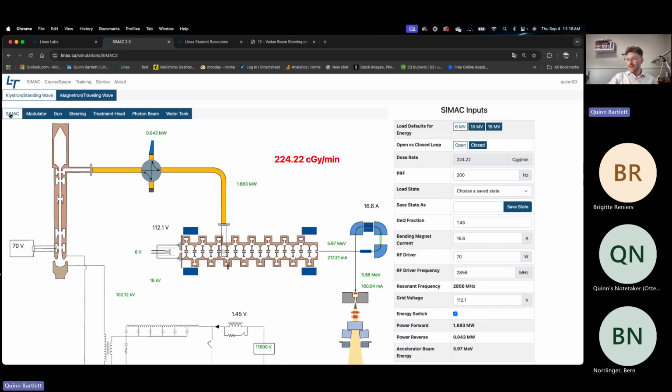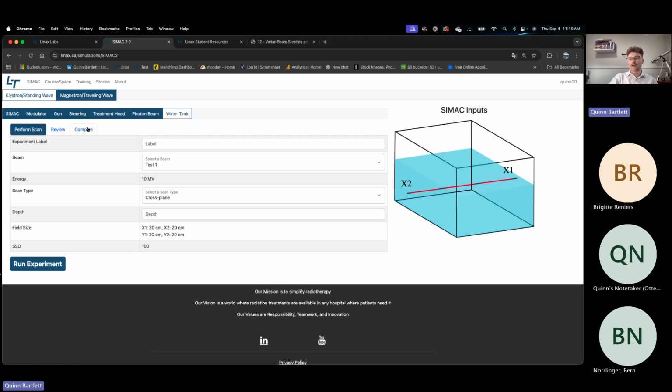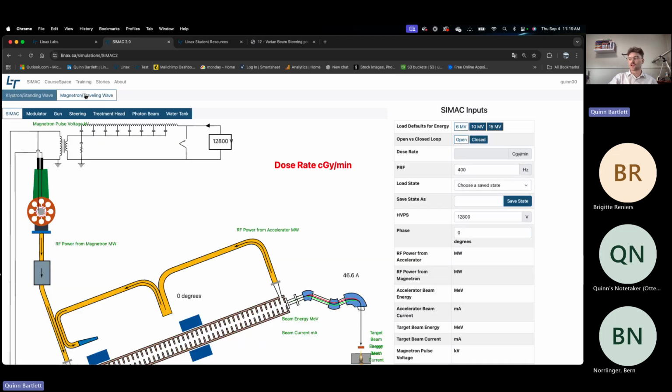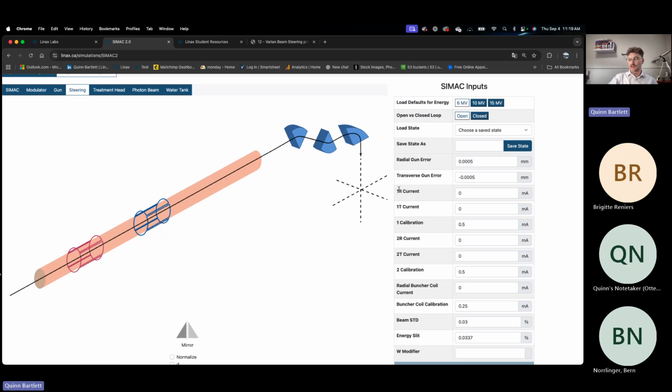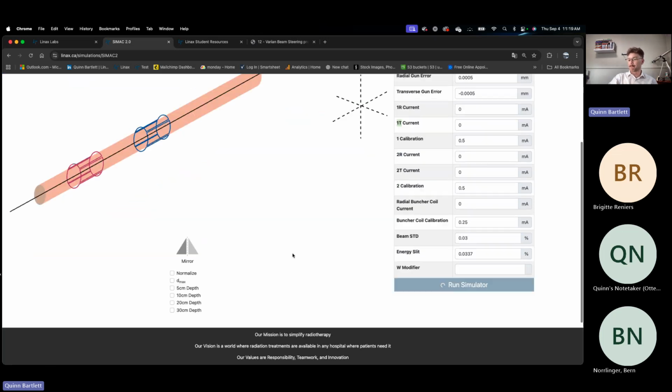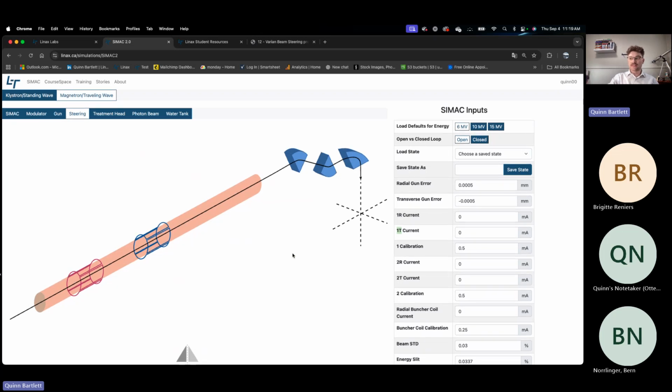Just trying to think if I forgot anything around the beam steering stuff. We also went over how to look at that in your water tank. I'll just show you on the magnetron side. You can see we do have the radial gun error and the transverse gun error, but then the currents on the coils are the 1R, the 1T, and the 2R and the 2T. So more accurate to what you would see in an Elekta environment.